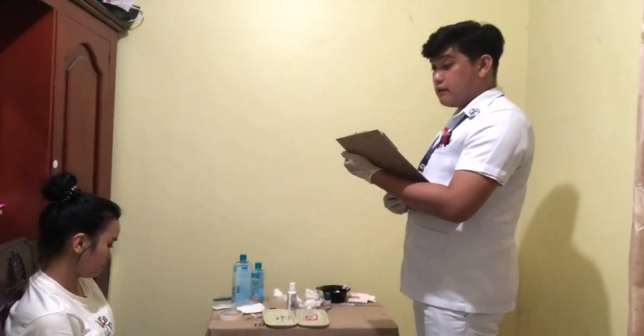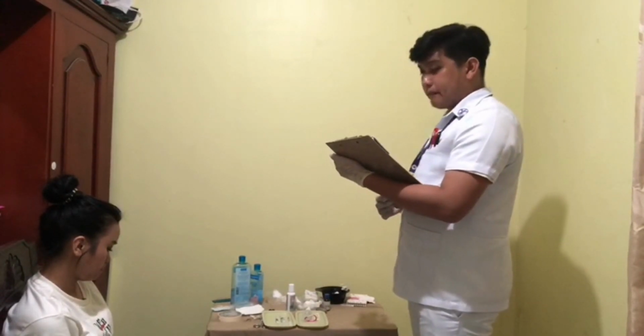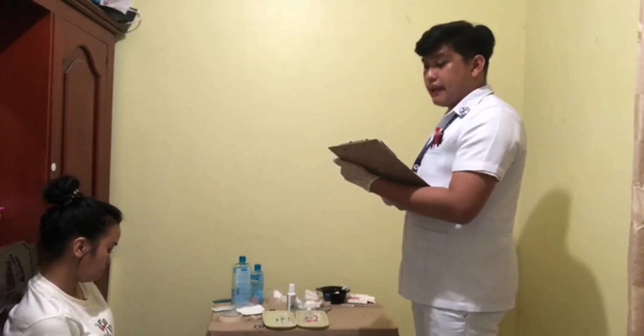This medication will be administered via intradermal route. This will involve injecting medication into your skin layer, and this injection will also produce a bleb or a blister, and you will also feel a slight prick as the needle enters your skin. Before I proceed, may I ask, do you have any concerns before the procedure, ma'am?